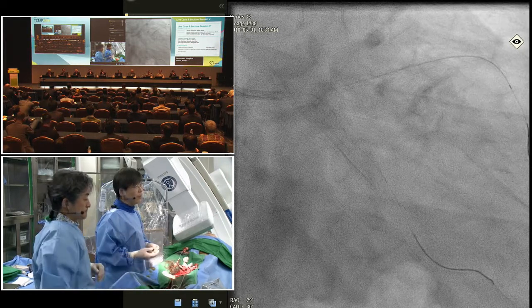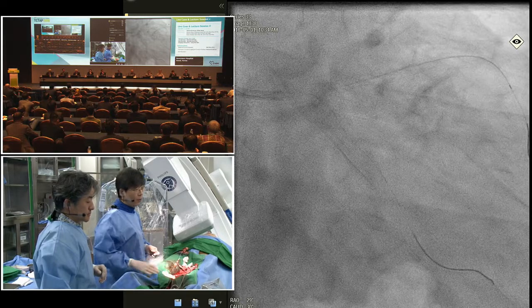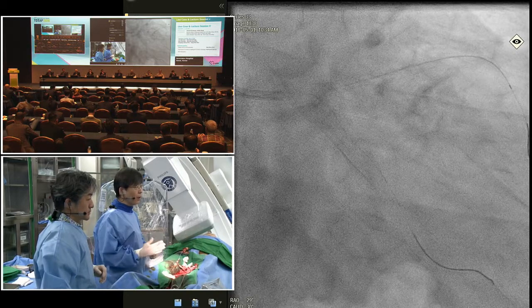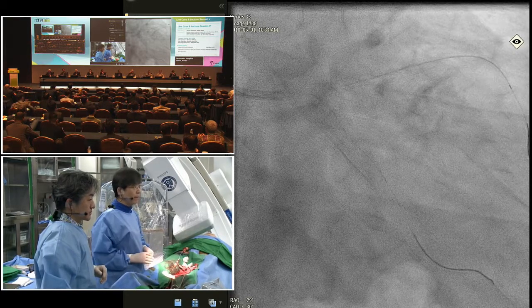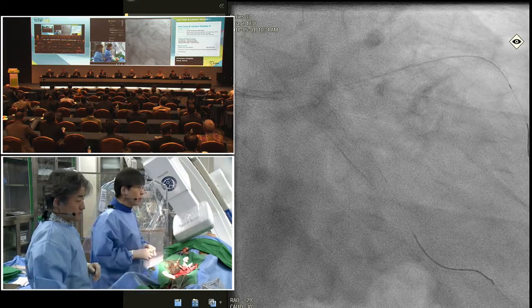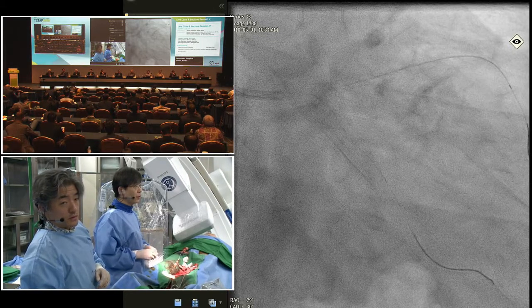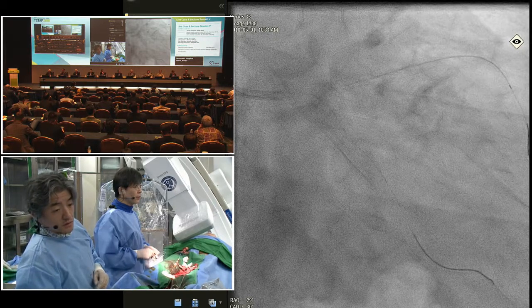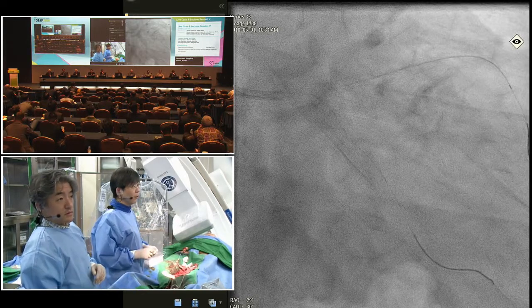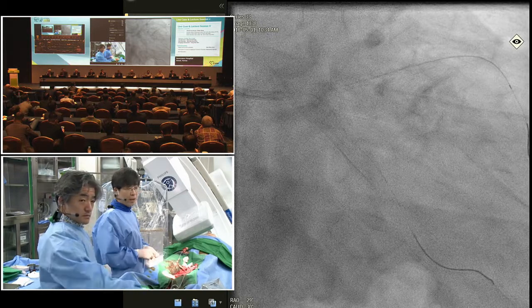The optimal stent was, first of all, the absence of stent strut over the side branch ostium, second, the stent fully apposed to the vessel wall, and finally, a larger lumen area at the ostium of the circ. So I will try to dilate in the ostium of the circ and the kissing balloon, and then validate the current status with IVUS.